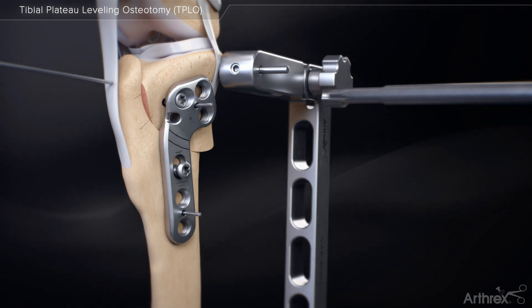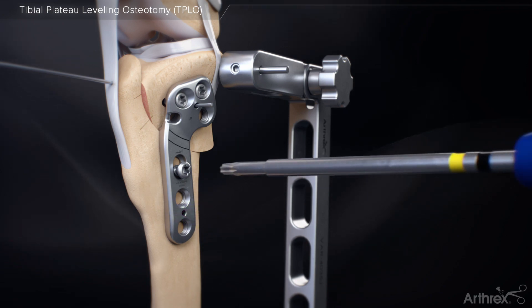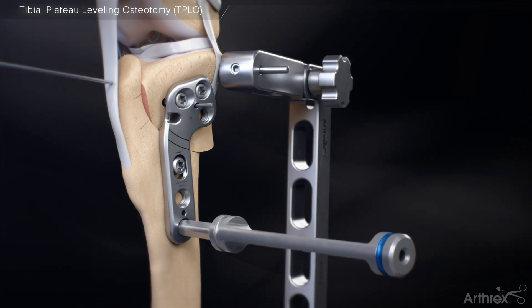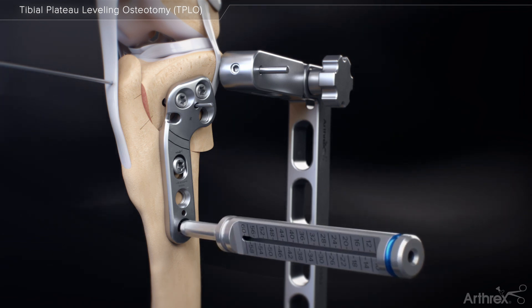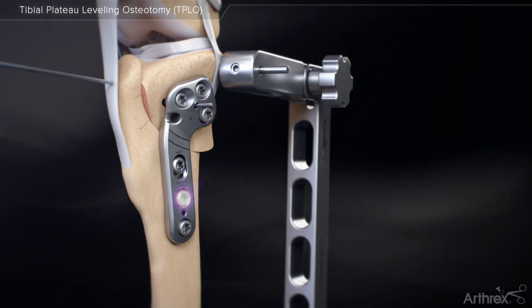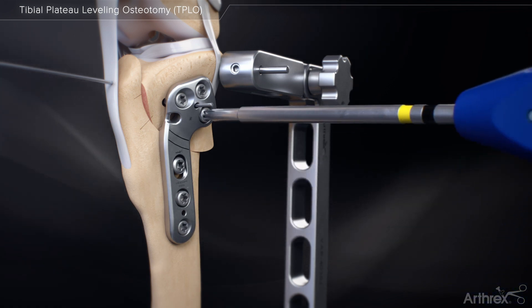Repeat steps for the second proximal hole. After removing the distal K-wire, tighten the compression screw by hand. After tightening the compression screw, insert locking screws in the remaining holes. Starting with the most distal locking screw, manually tighten each screw with a screwdriver.